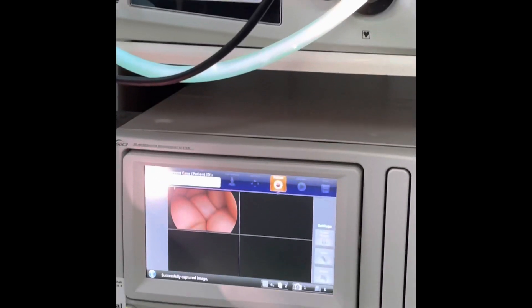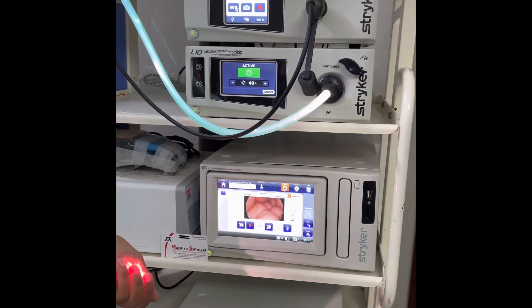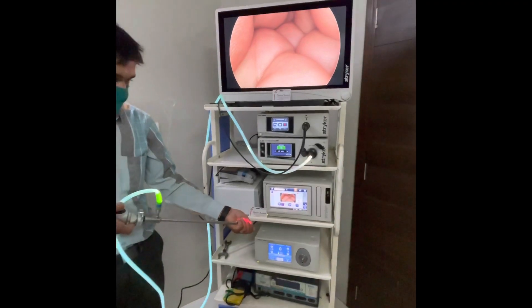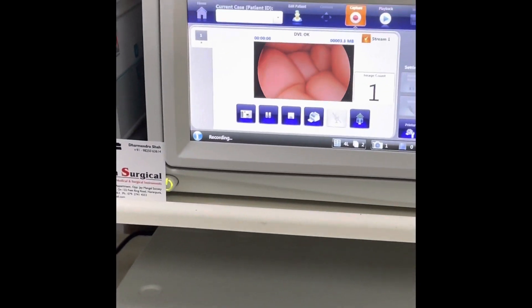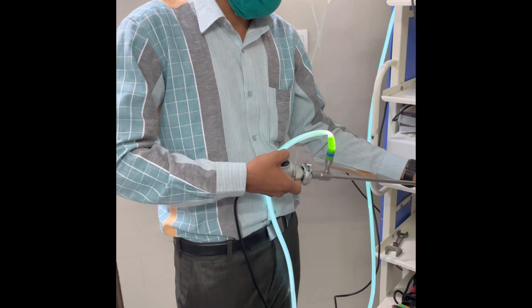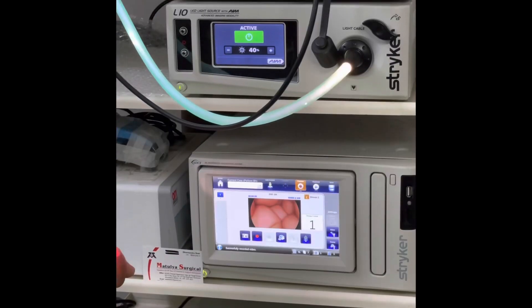As you can see, I captured the image, and I can also start recording with my camera head. I am starting the recording now — as you can see, this is recording. I can also stop the recording whenever I want using my camera head. Now recording is off.